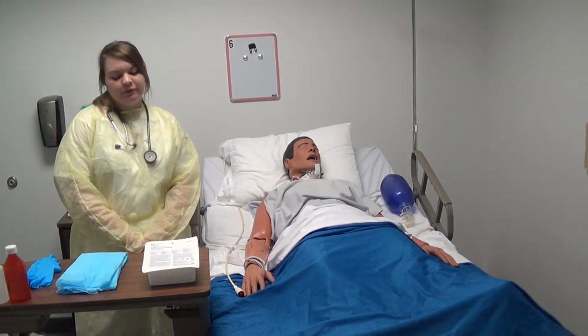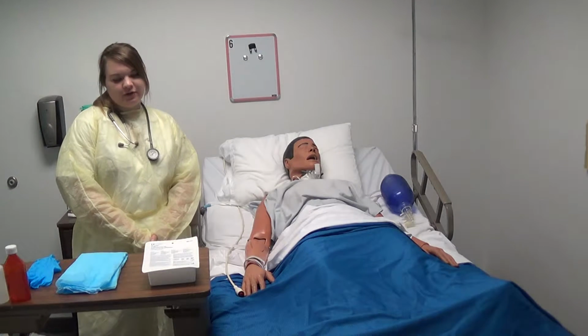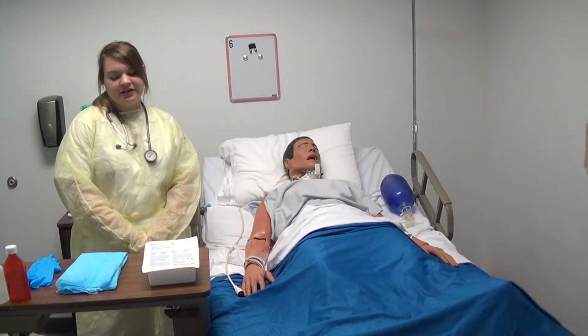Today I'm going to perform trach care, which I do not need an order for. It's just a normal nursing intervention.